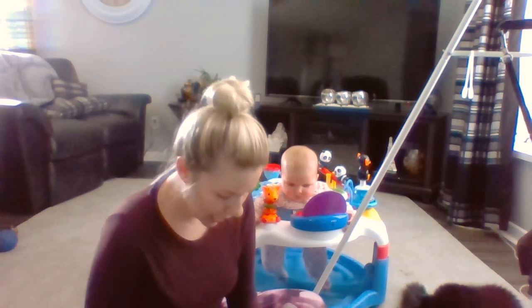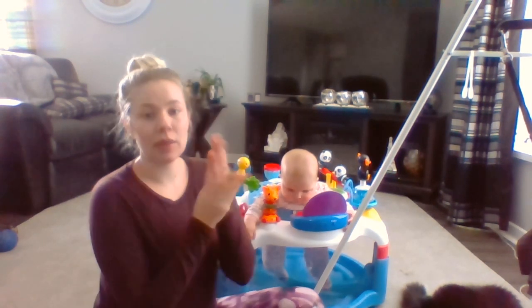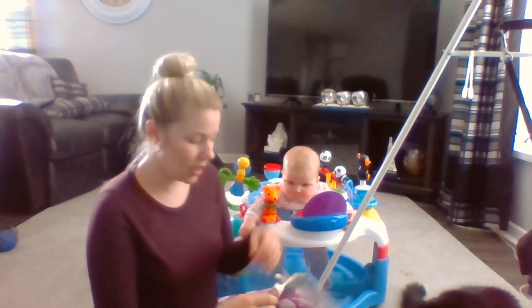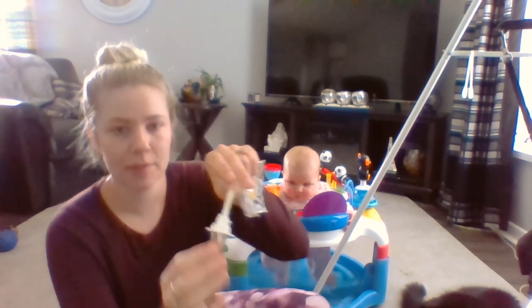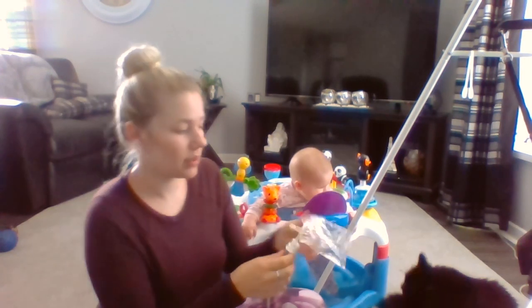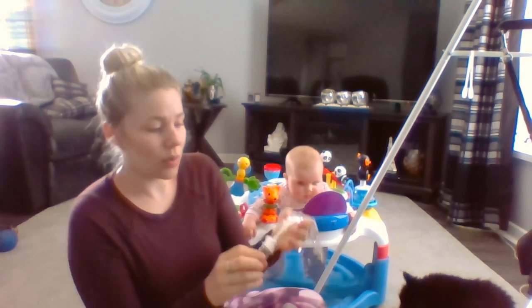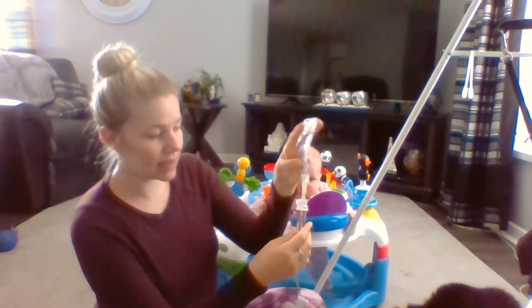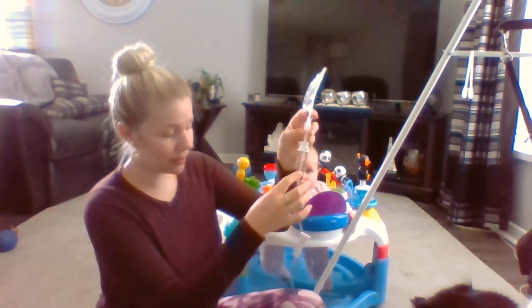Okay, I open that. I'm going to use aseptic technique, so I'm going to wash my hands and perform hand hygiene. And then the first thing that I'm going to do is spike the bag. For this spike, I would take off the cap. This is sterile, so no need to sanitize it. Because it's sterile, I do not touch it. I would push it into the bag to spike the bag. Once that's there, it could start flowing.